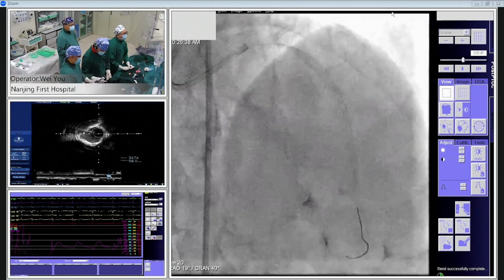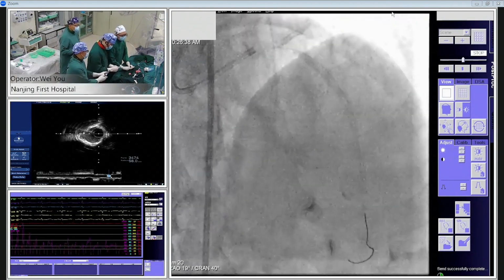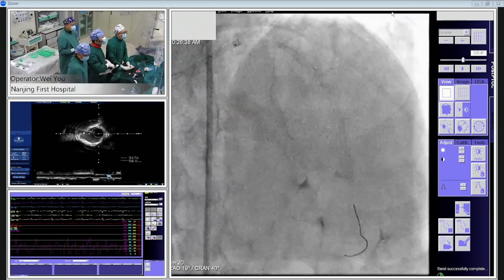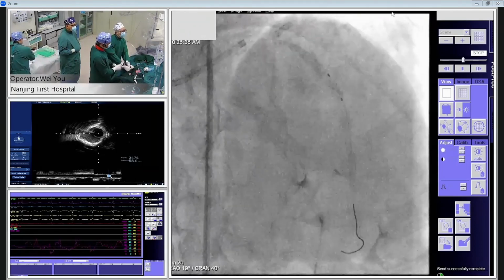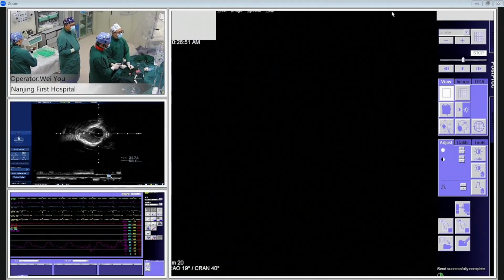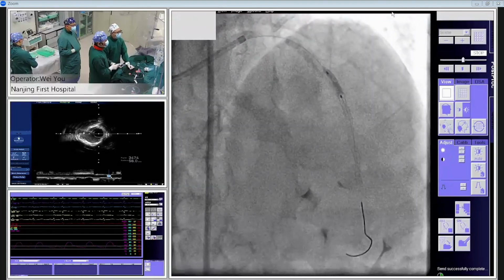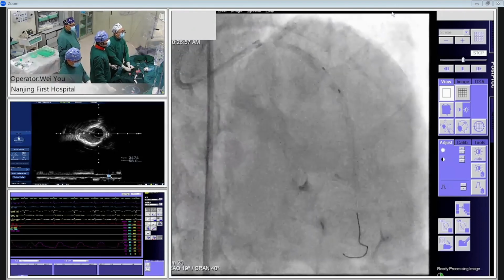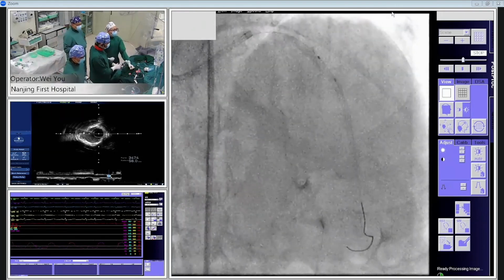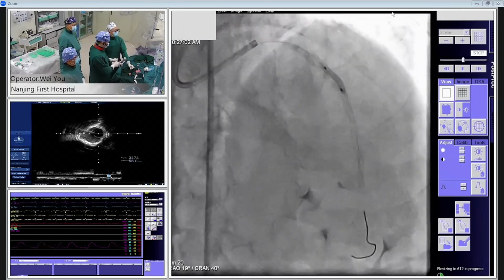We just deliver the 2.75 NC balloon to pre-dilate the proximal segment. Okay, here, go, inflate. 10. Normal pressure 12, 14. Okay, seems better. I retrieve the balloon. Okay, go. Here is the site we should do the high pressure. 14, 16. Okay, better than before.